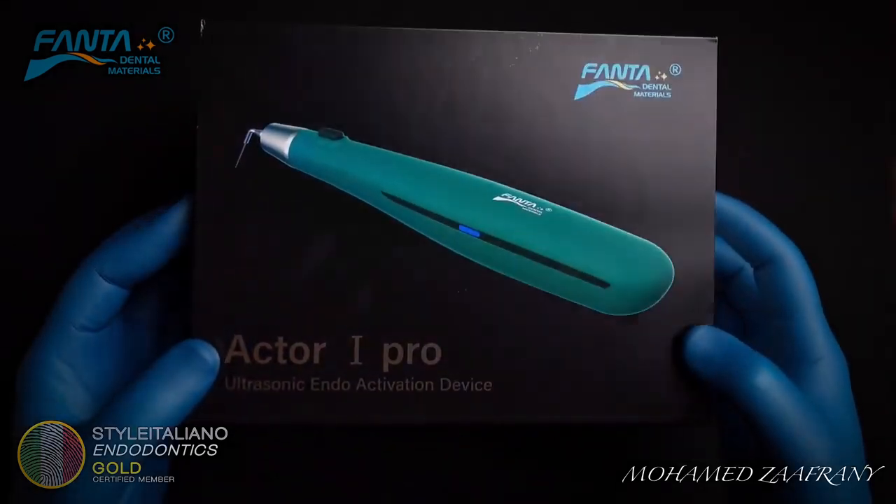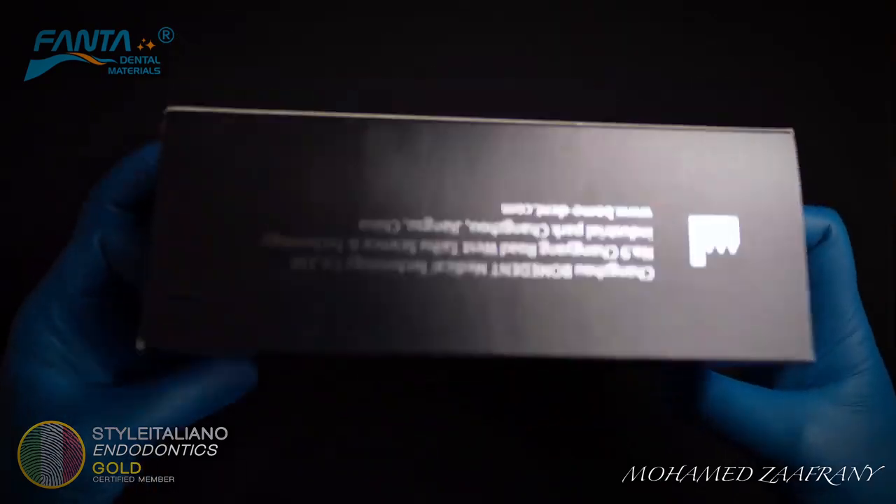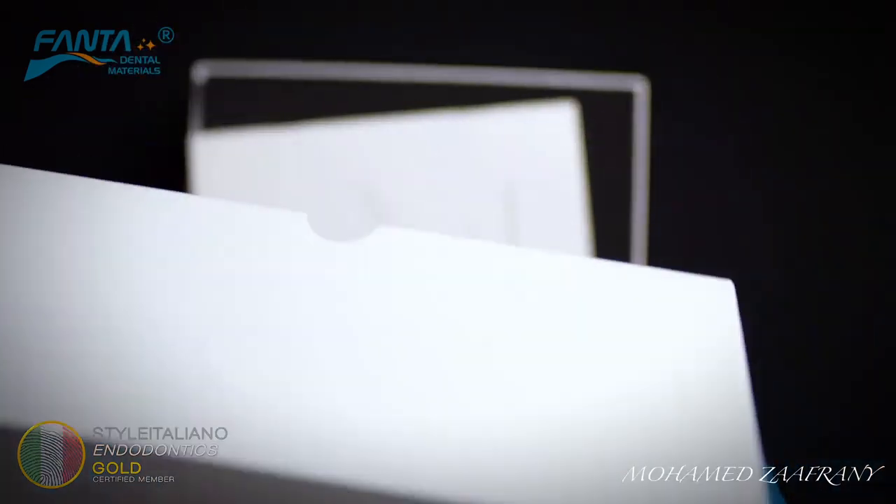Hello everyone, this is Mohamad Zafrani and today I'm introducing to you the Actor I Pro, the new activation device from Fanta Dental Materials.